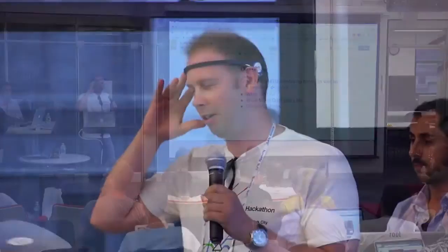So the way an EEG device works is that it detects your brain signal as long as you're not moving. And if you move, like blink your eyes or something, that muscle movement overwhelms the brain signal. And so you can easily pick it out with your eyes. So we thought this would be a pretty easy test for an HTM. We're just trying to get up to speed on HTM and how it works and how to program with it.